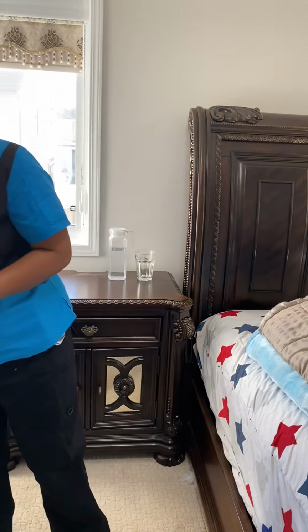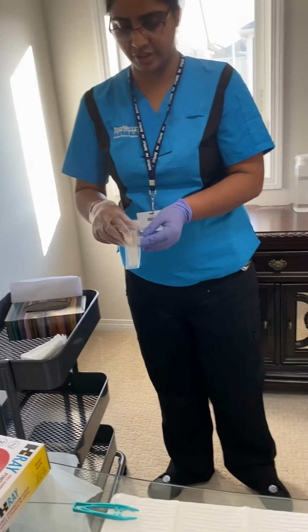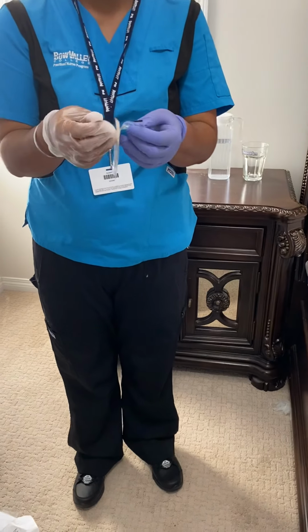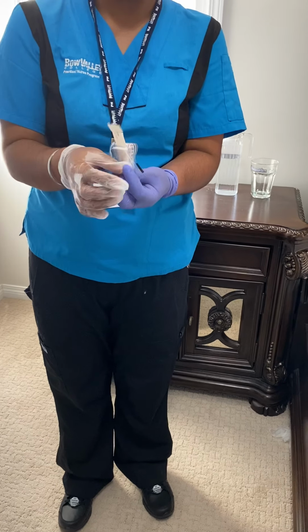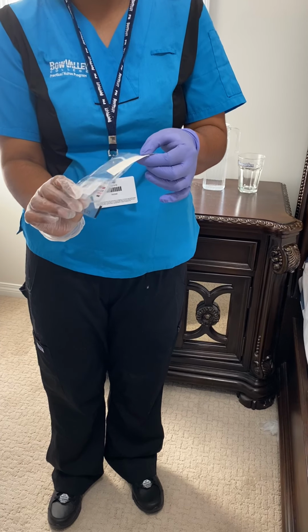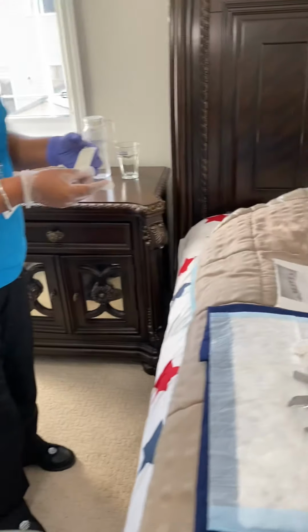So here is my steri strip. I peel it like a banana, take it off from the cover and put the cover in the garbage.